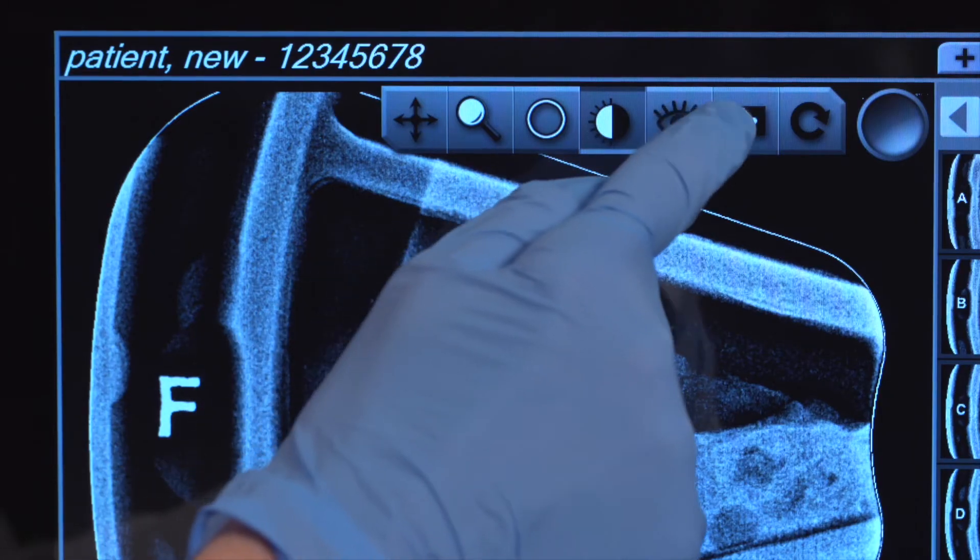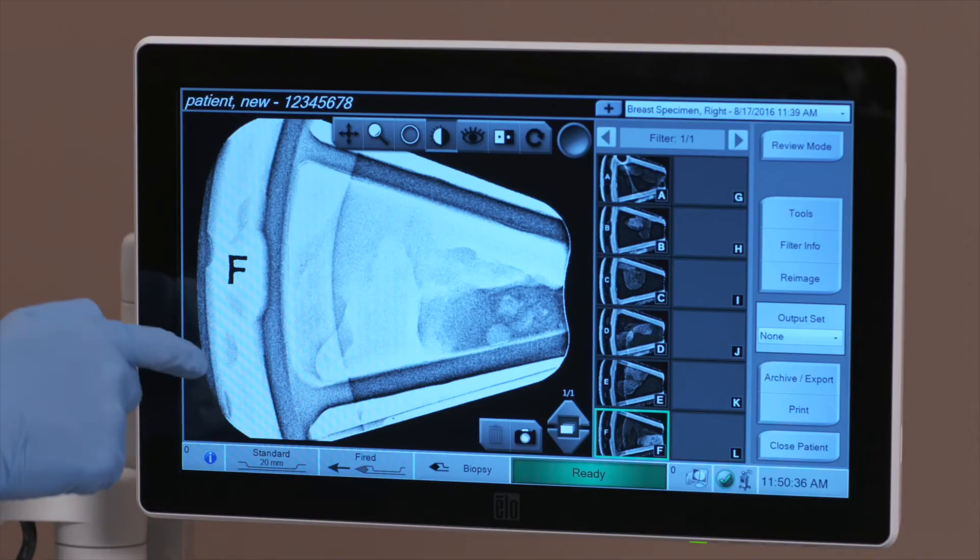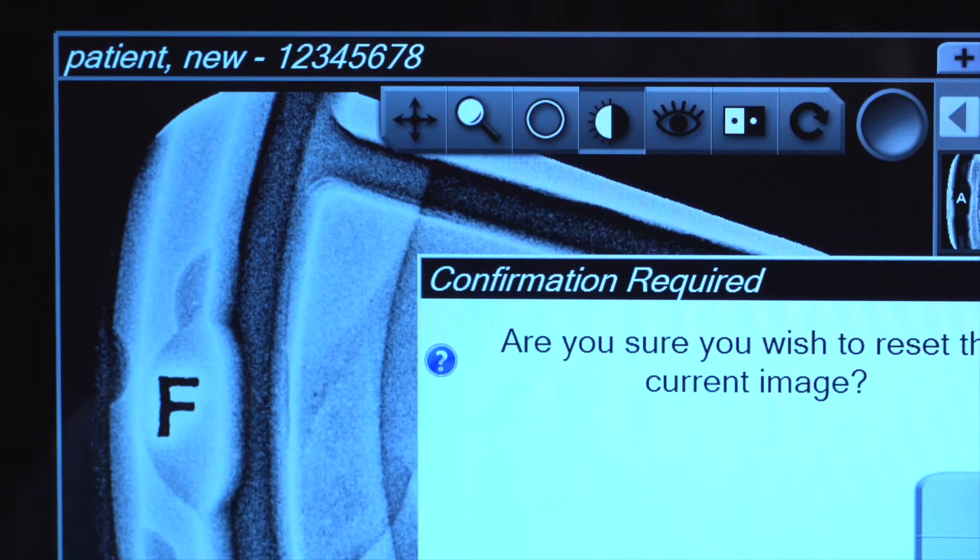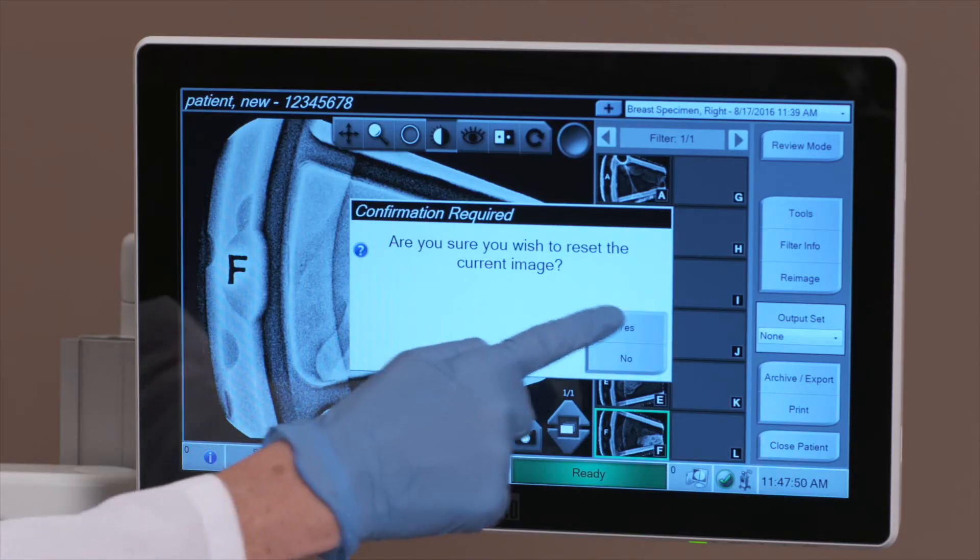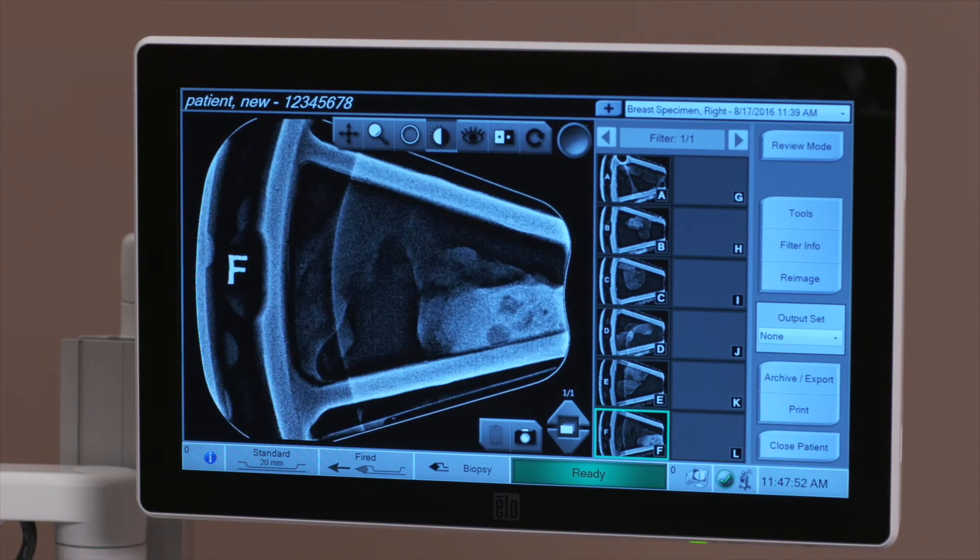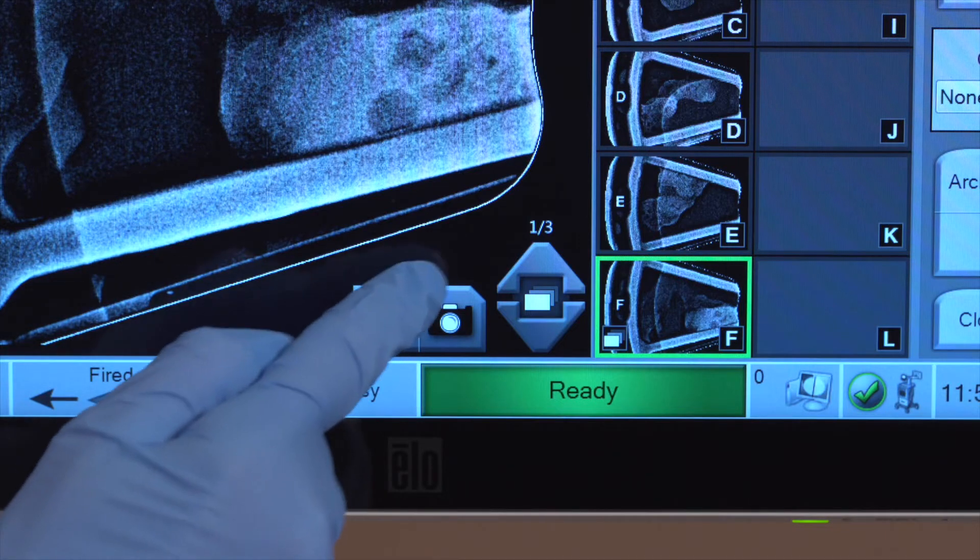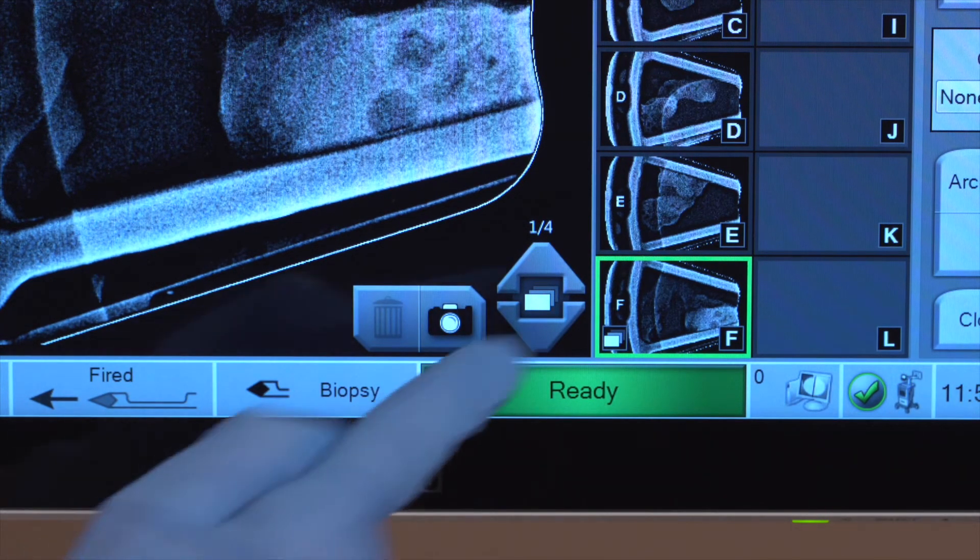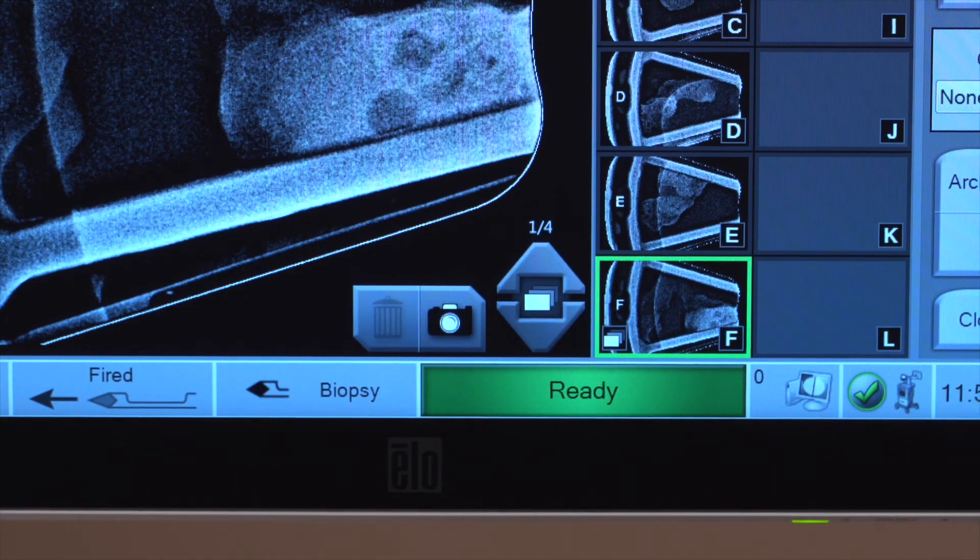The invert tool creates an inverted version of the image. The reset tool returns an image to the original state. Any annotations, panning, zooming, etc. are removed. The camera button captures a snapshot of the image display area and adds the snapshot to the current procedure.